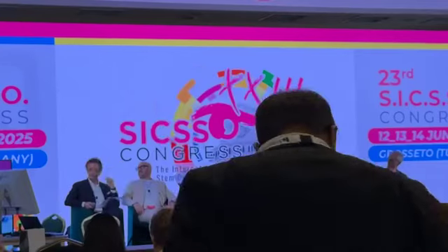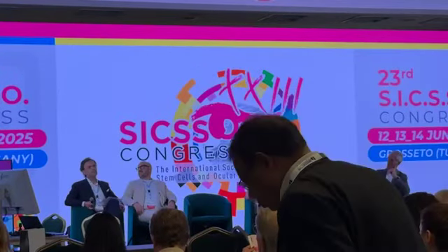Yeah, keratoplasty is a wonderful surgery for the cornea, but we do not have enough tissue for keratoplasty for everyone. And sometimes we can do something different. That means that we can offer the patient a faster recovery than keratoplasty using a laser regularization of the cornea associated with cross-linking. So that means the cross-linking plus.